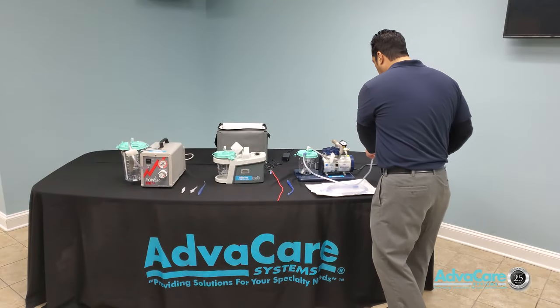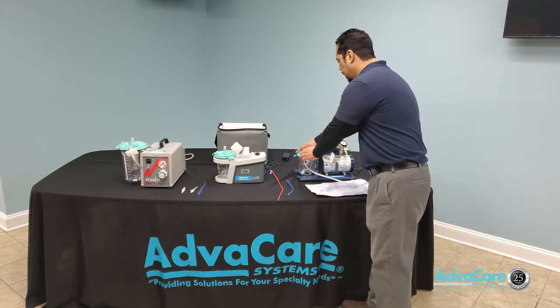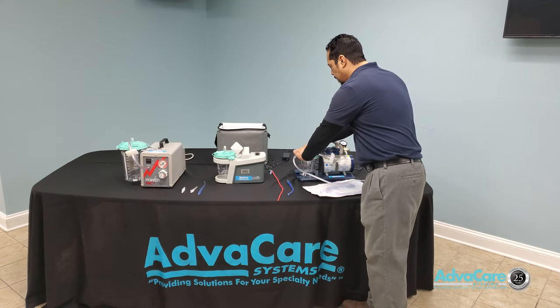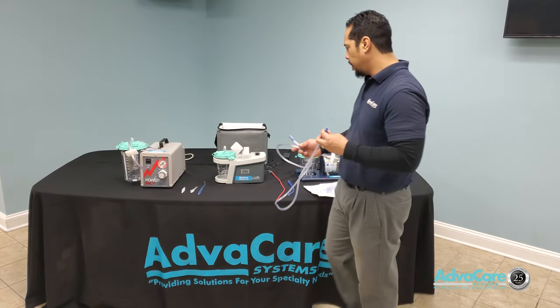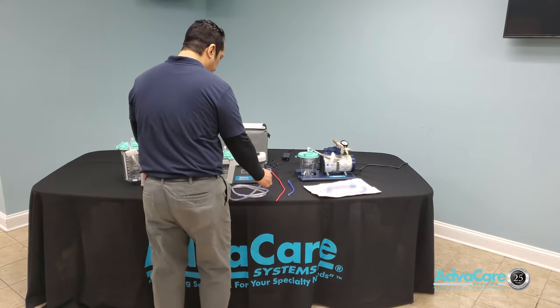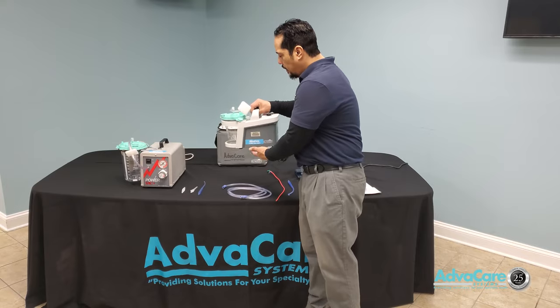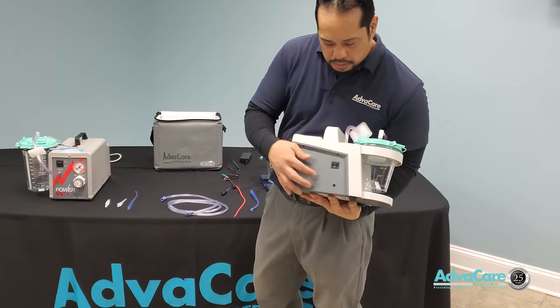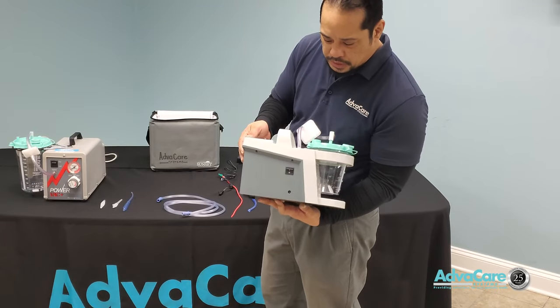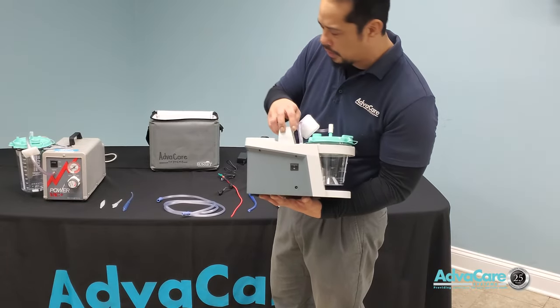When it comes to the portable suction machine, it operates in the same manner as the stationary, providing continuous suction therapy. However, it is portable and battery operated. There is a port on the back side of the machine to plug in for charging, along with your power button.